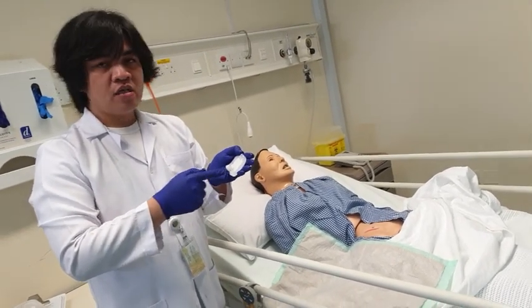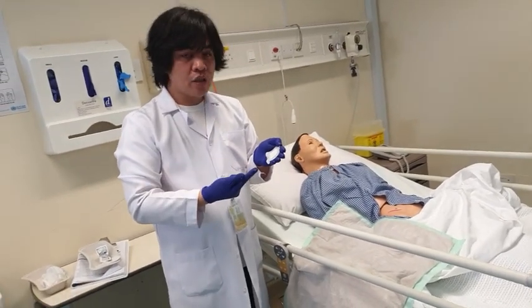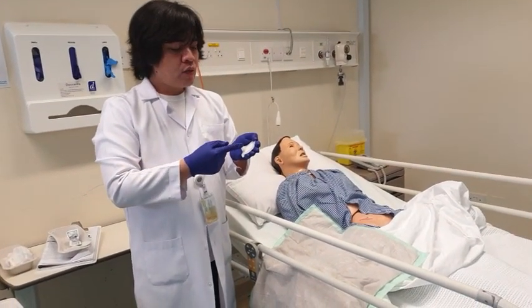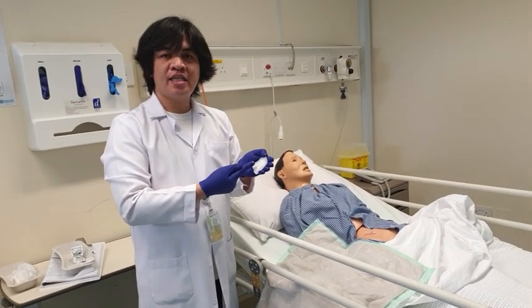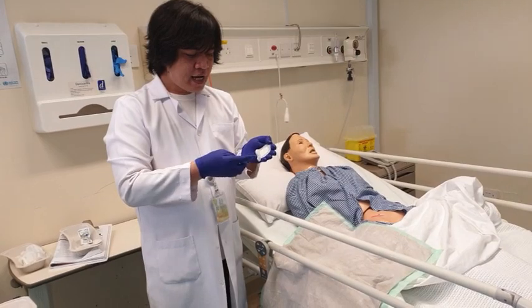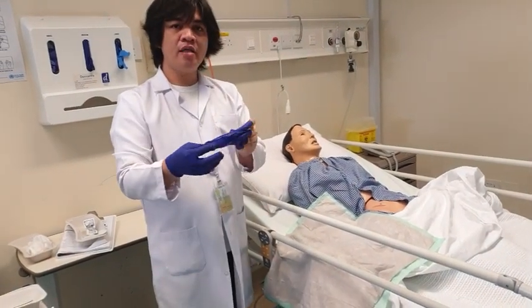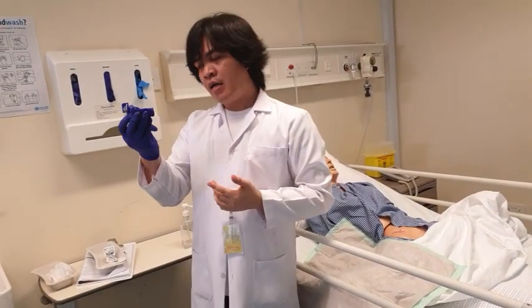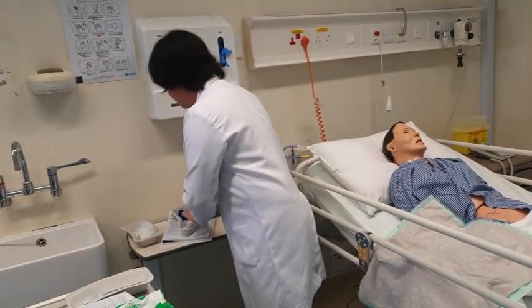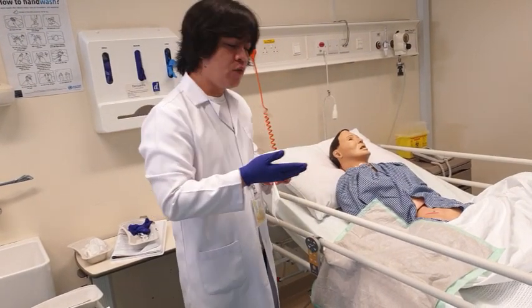Try to assess for the odor, try to assess for the drainage, and try to assess also if it is saturated with blood and so on. And after that, with the use of your gloved hand, dispose of this together with the gloves. Now, at this point, you proceed with the assessment of the wound.